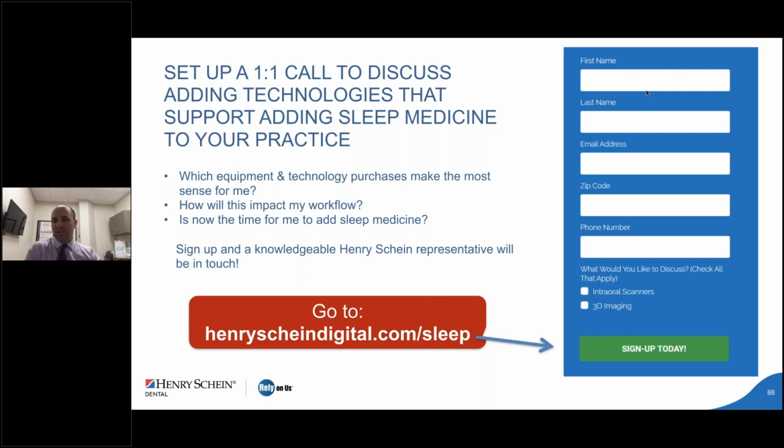But I really don't see the role for panoramic film anymore. The radiation dose is just as low, if not lower, with cone beam. It gives you more information, and I think it's been deemed the standard of care in implant placement, having a cone beam. So I do think the trend is going to be, as the radiation probably gets better and better, that we're going to see it becoming more and more common practice.